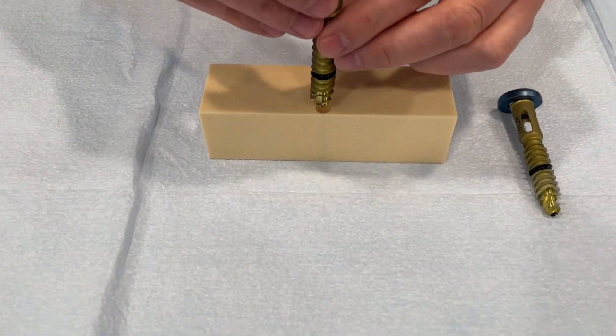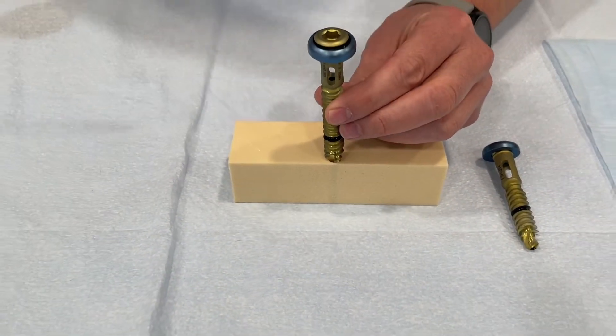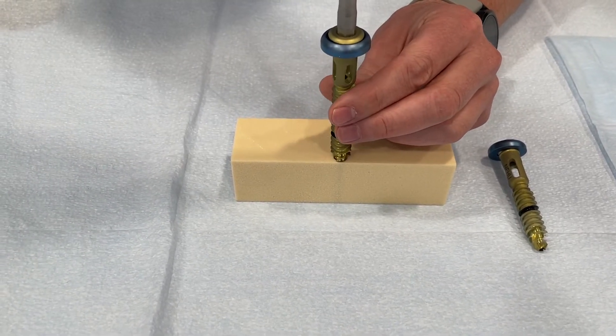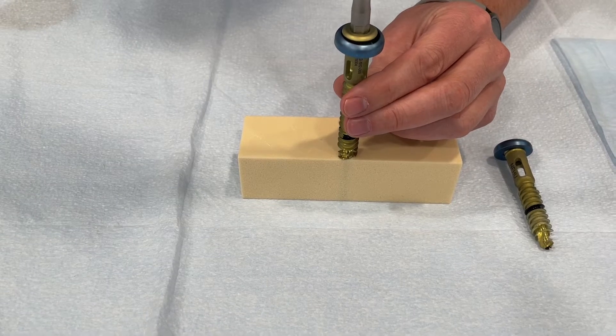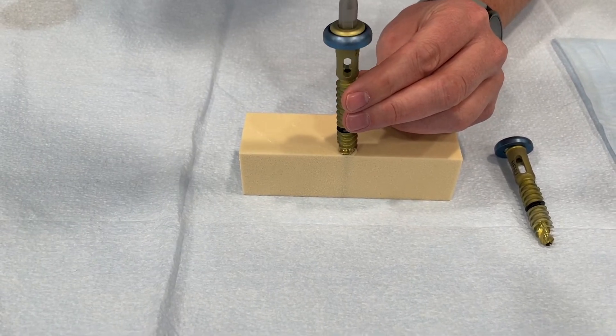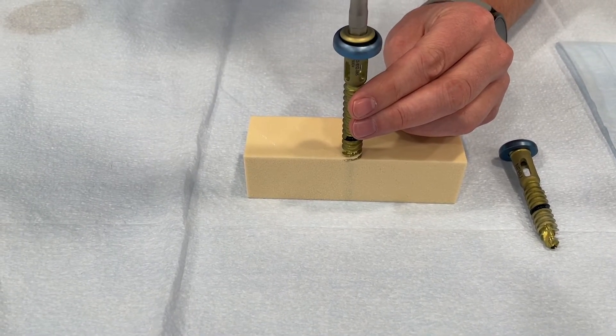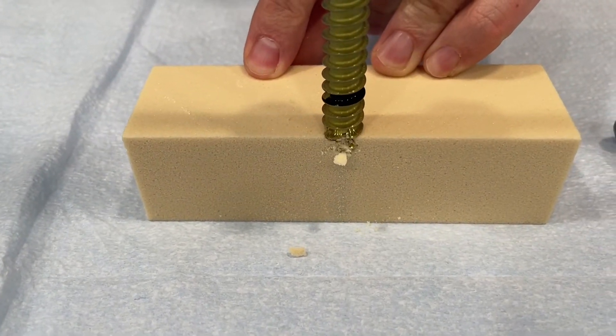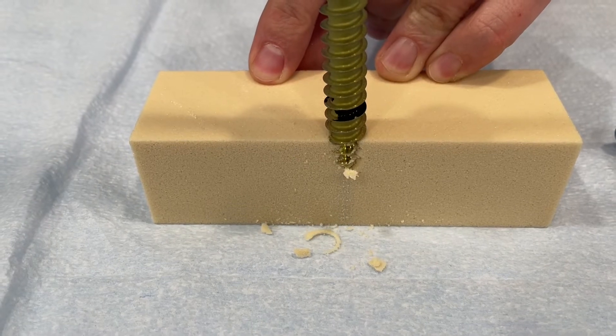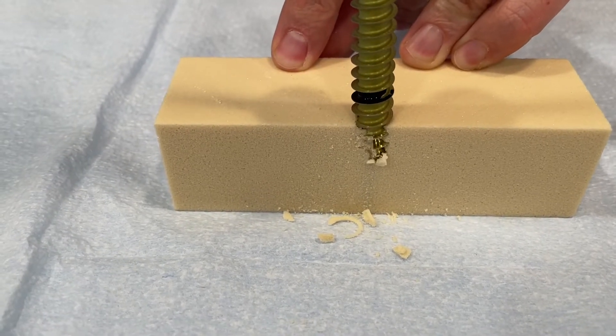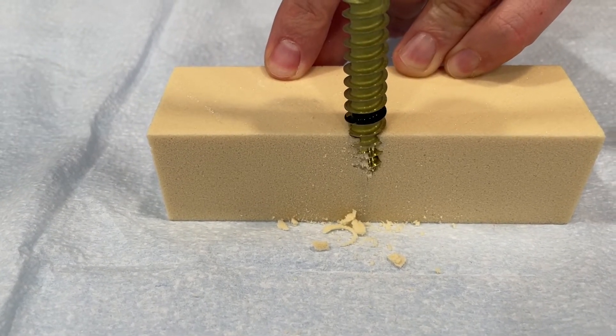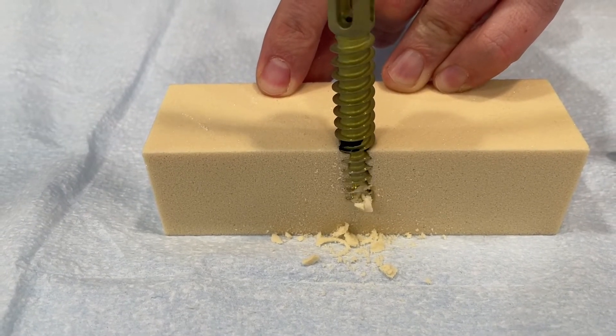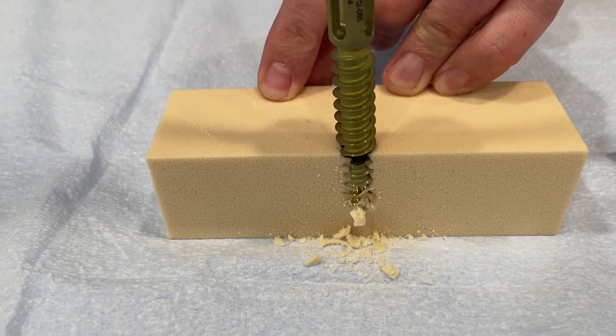So here we have the original screw. We're going to do our best to make sure it goes in nice and straight. We're going to insert that all the way down until the top of that black thread is integrated. You can see what it's doing as it goes down in. A few more turns, one full rotation, stop right there.